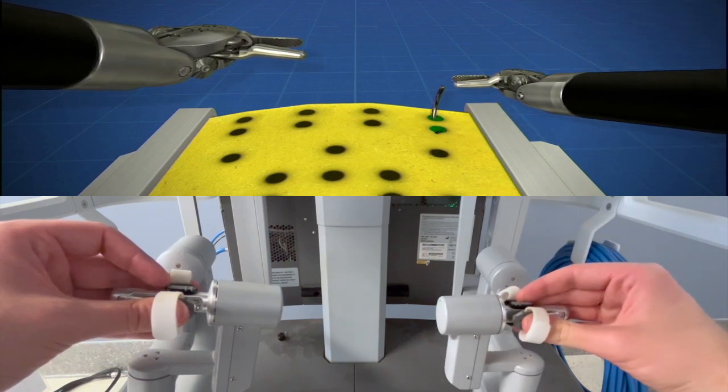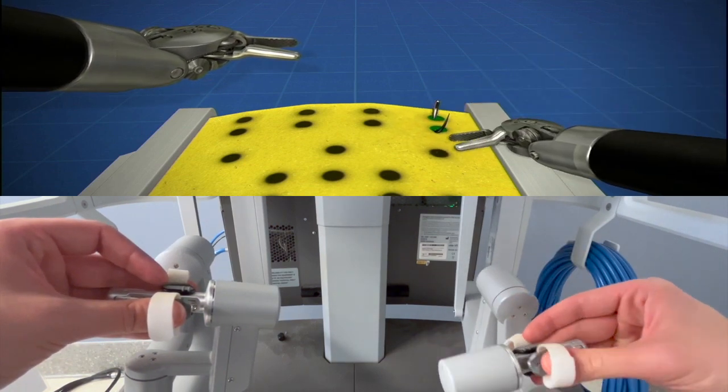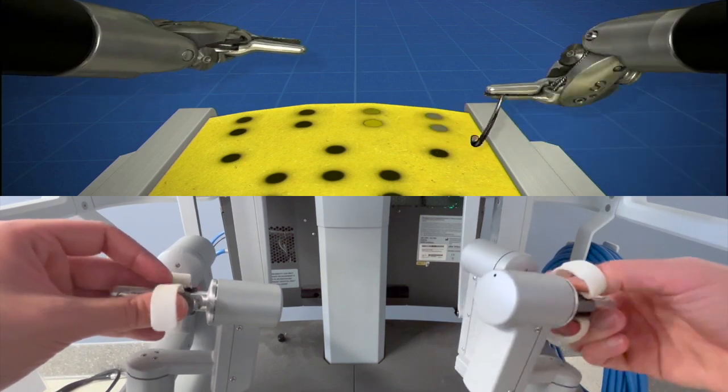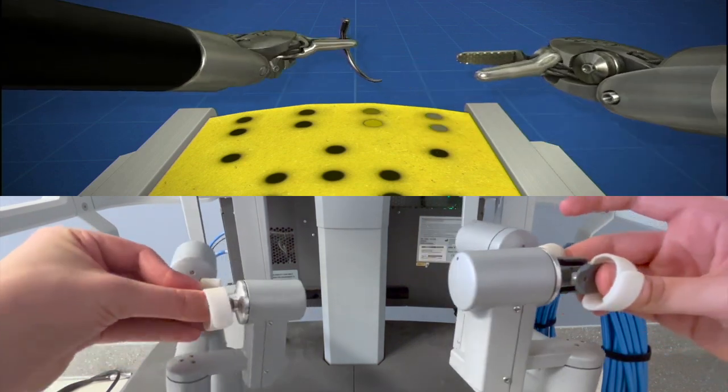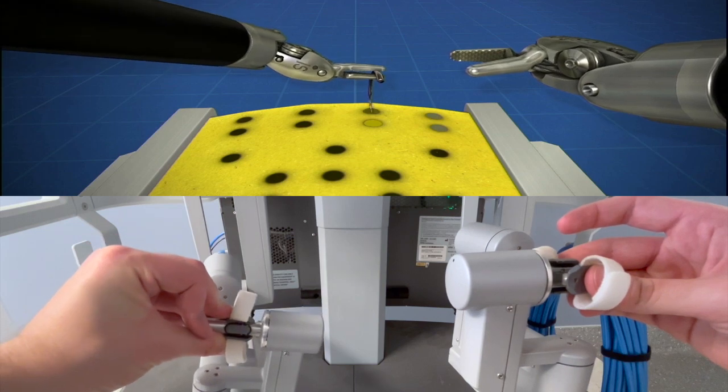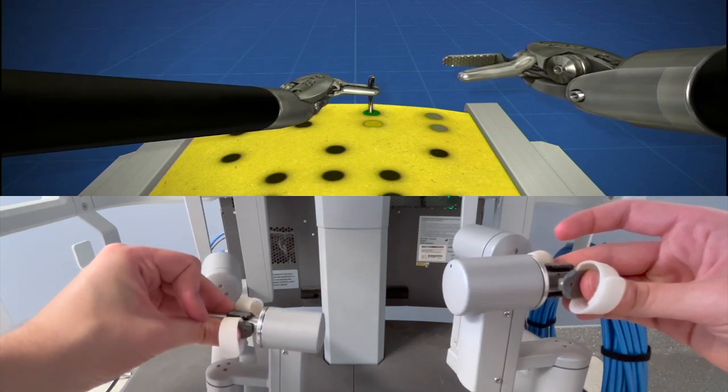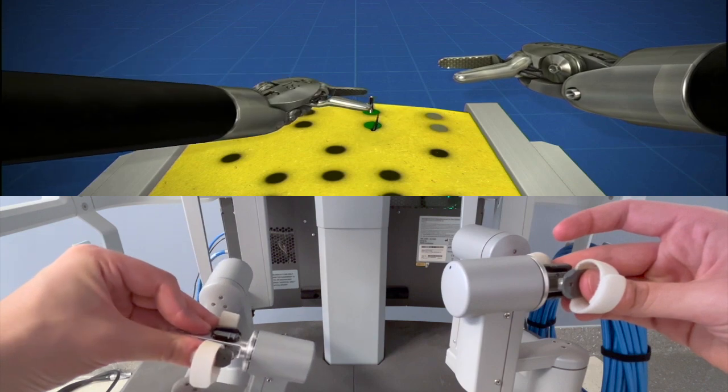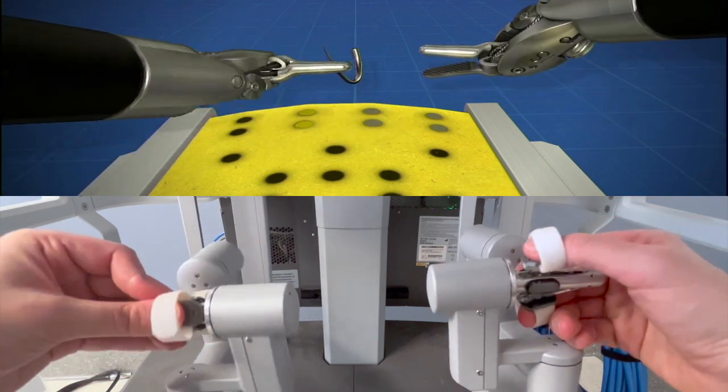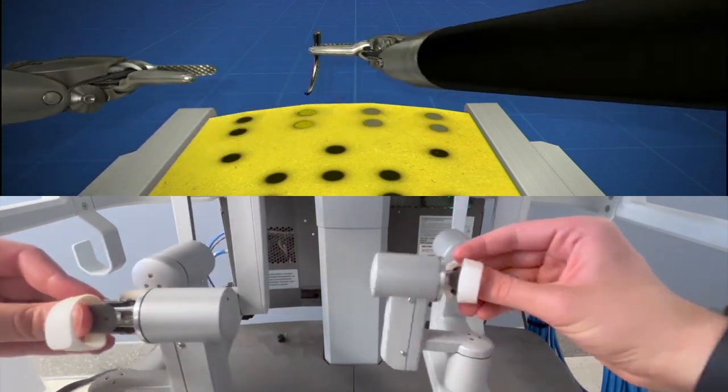As with any exercise, this is a little bit more simple. You just have to take four bites in a row. It doesn't matter which hand you use. Here I'm going to be using alternate hands because it's more efficient in terms of me not having to switch the needle constantly between my hands.